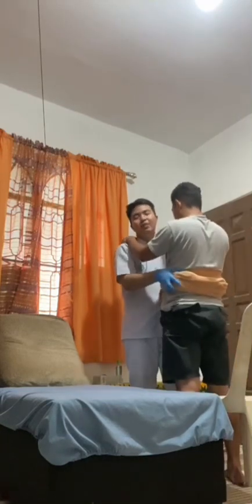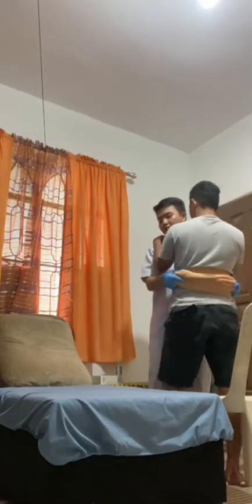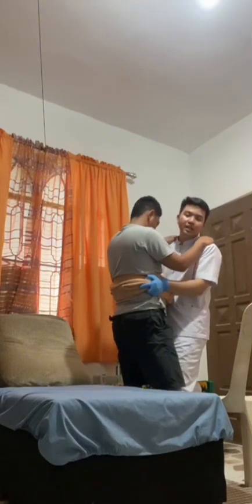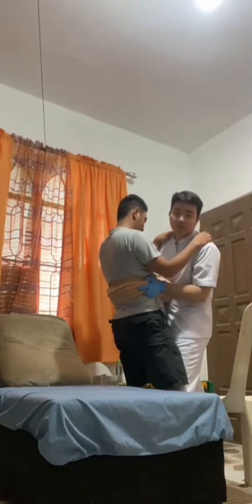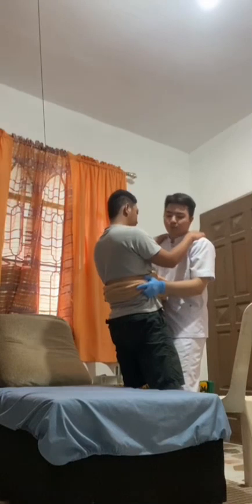Now, sir, in a count of 3, we will stand together nice and slow. 1, 2, 3. Now, I will assist the patient in going to the center of the bed. 1, 2, 3. And before making the patient sit, I will make sure that the patient is in the center of the bed. And sir, in a count of 3, we will sit down together. Nice and slow. 1, 2, 3.